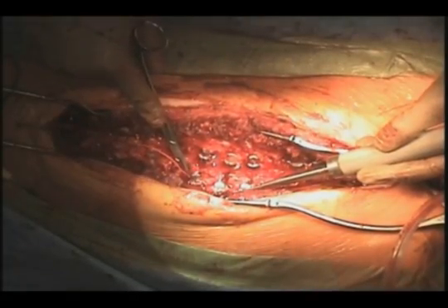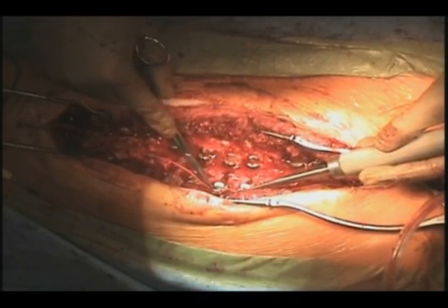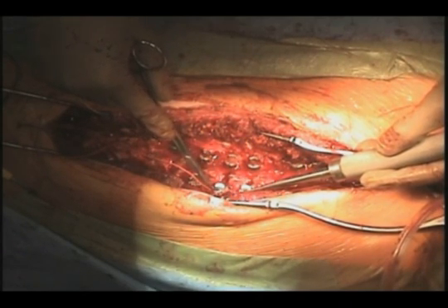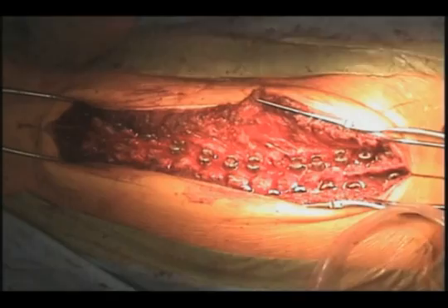Well, after we've placed both concave and convex screws, and I've already done that, we then do evoked EMG monitoring. We stimulate the center of each screw in order to test the threshold. As you increase the current, there is a reading distally at the lower extremities.